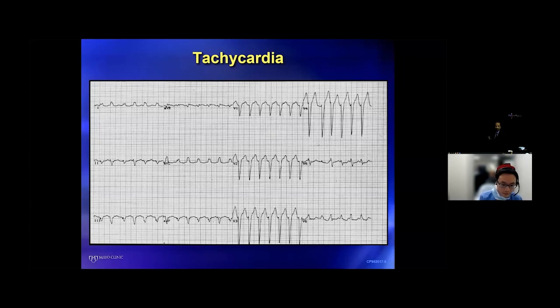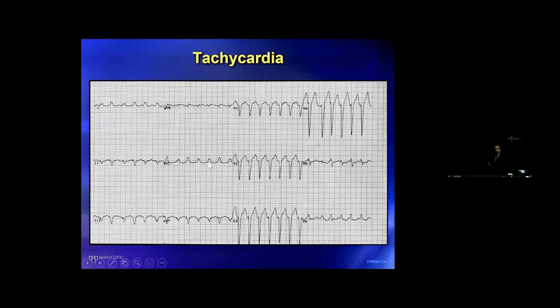Excellent. So with the wide complex tachycardia, if this was a VT, we would say right ventricle inflow somewhere near the exit of the right bundle branch. But suppose this was a young patient, structurally normal heart. Any other arrhythmia come to mind where you could have the earliest activation in the V a little further away from the annulus that's actually an SVT?